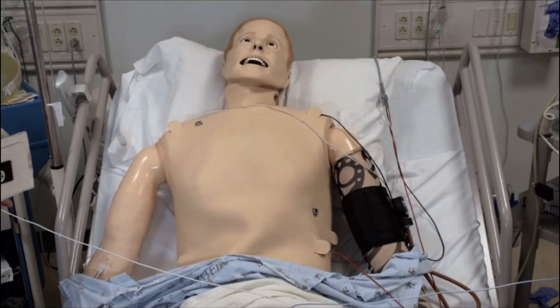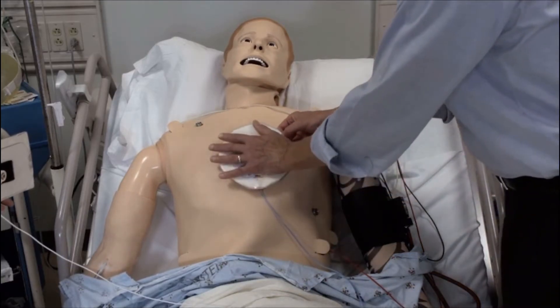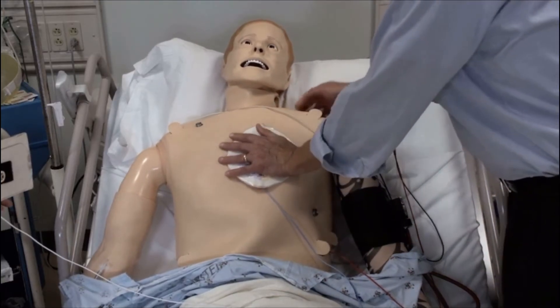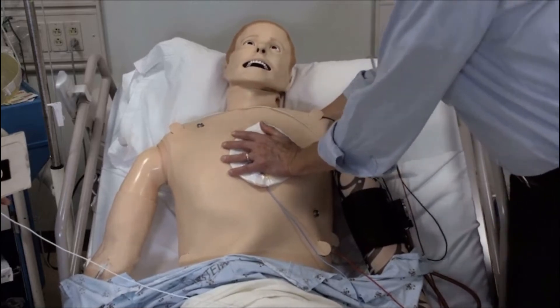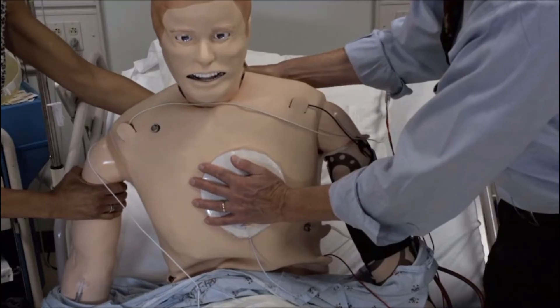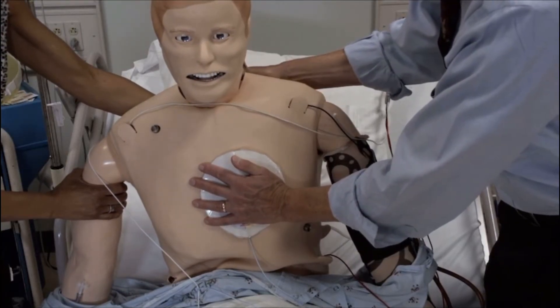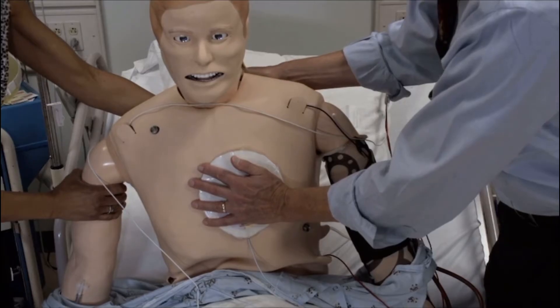In patients with a large chest cavity or overlying breast tissue, the anterior-posterior placement may be more useful. Only adhesive pads should be used, not paddles. Place the anterior pad just to the left of the sternum in the third or fourth intercostal space. Place the posterior pad to the left of the spine and the back below the left scapula. In this position, the heart is sandwiched between the anterior and the posterior pad.